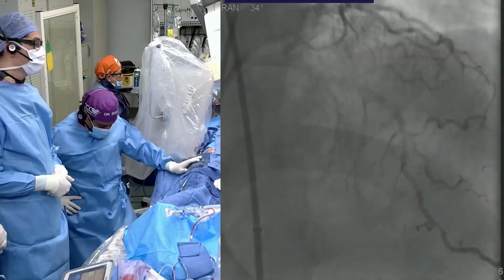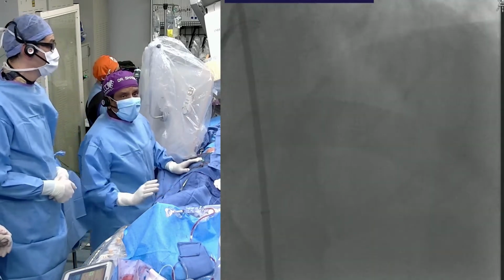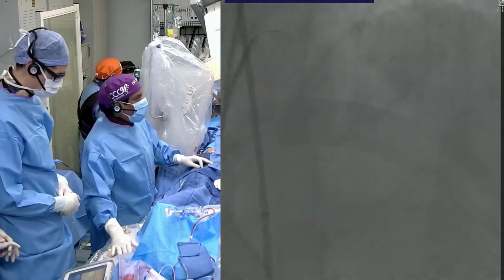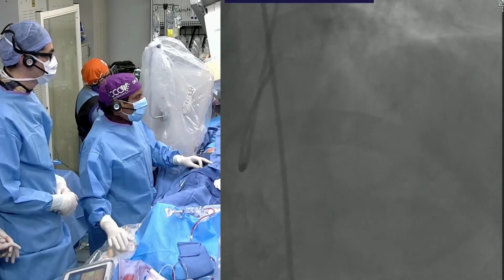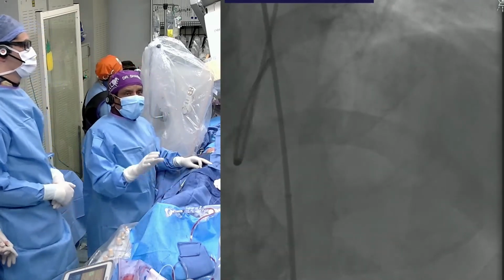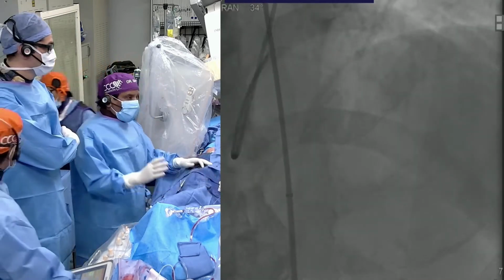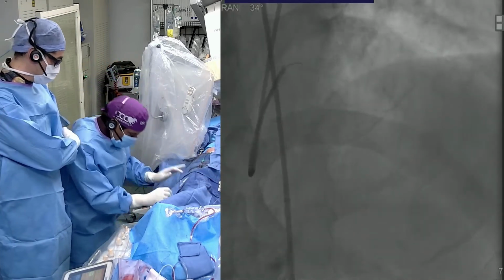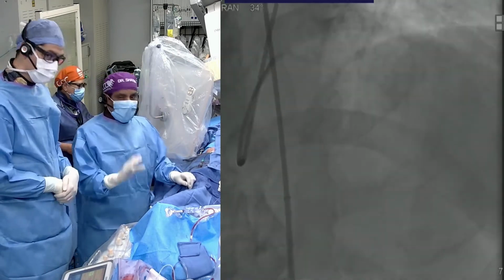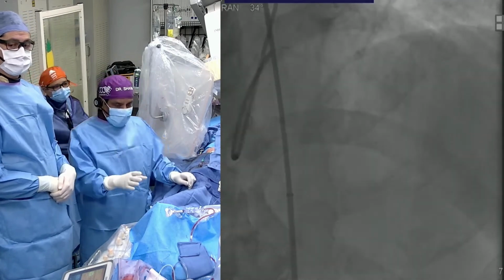And I always say for the calcium, before you give the dye, you take a clear cine on those cases, and that will tell you the tram track point of view. See here, you see the whole tram track of the vessel. It's the severe calcium. Is it severe calcium? And then of course there is aneurysm. You'll have a discussion on what our goal is. In this case we have a ROTA cut strategy: rotational atherectomy and the ROTA cut trial with the cutting balloon.